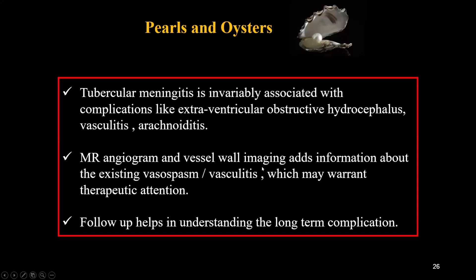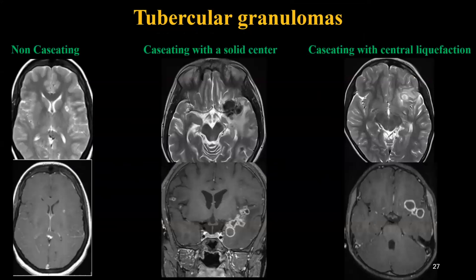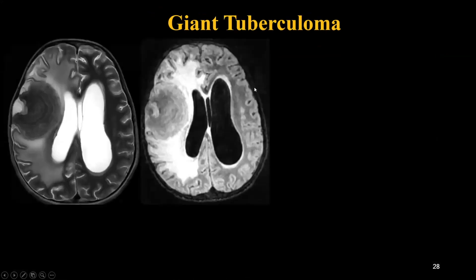Talking about tuberculomas: they can have a granuloma form which can be non-caseating, which is hyperintense on T2, or caseating with a solid center — a T2 hypointense lesion showing peripheral enhancement — or caseating with central liquefaction, which is a T2 hypointense periphery with a central area of hyperintensity that may show diffusion restriction and will show peripheral enhancement. These are the different forms of tubercular granuloma commonly encountered.